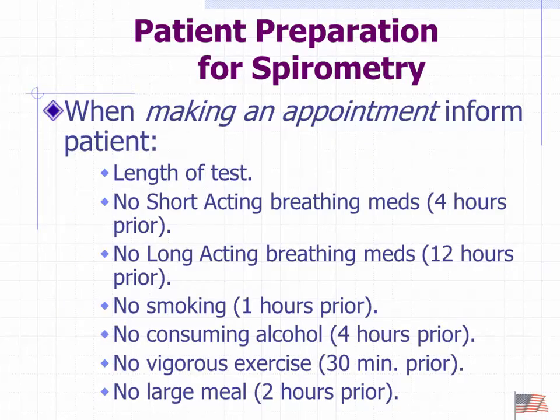So, again, we talked about preparing the patient. They should know how long it's going to take. This is not a 2-minute test. This is going to be an hour that you're going to be here, because there's multiple things that we need to do. Don't take any meds within 4 hours. So if you're scheduled to take the meds, come on in. We'll have you do the test and take the meds after.